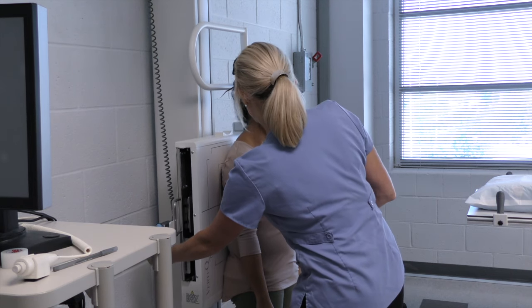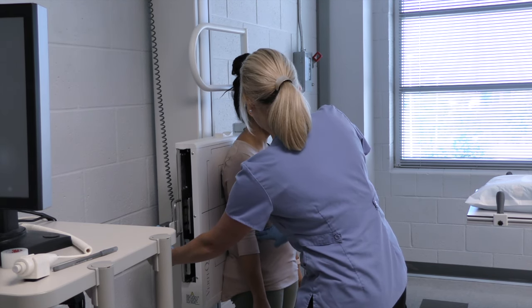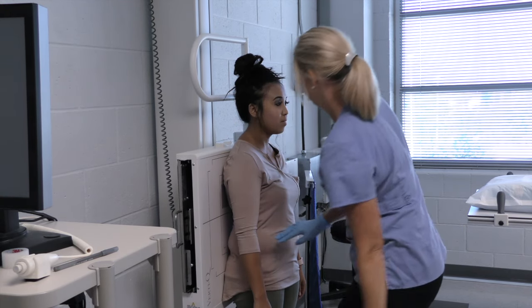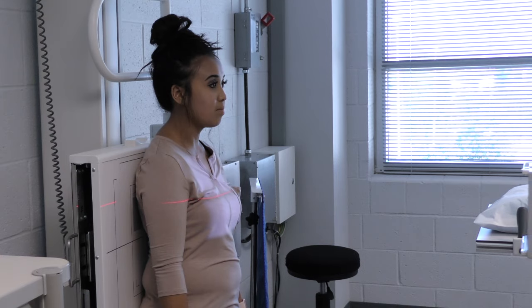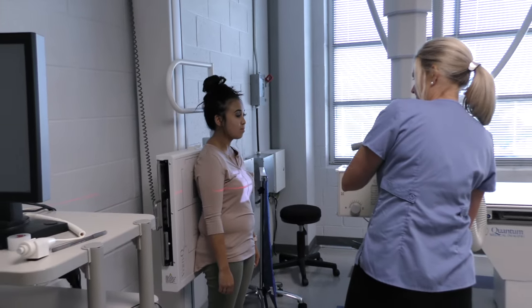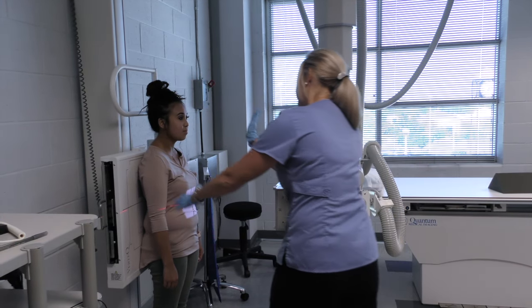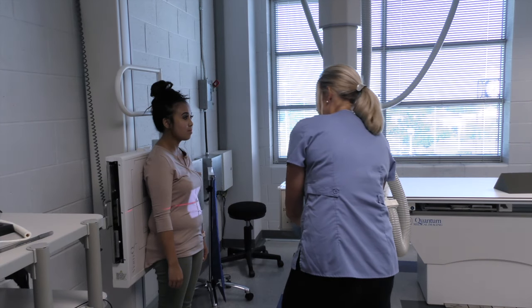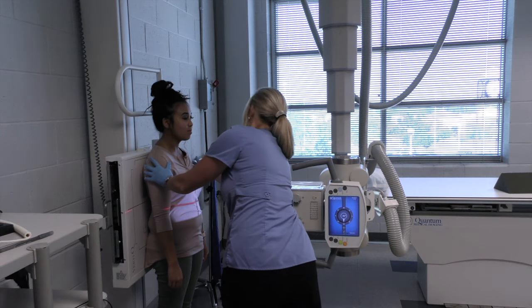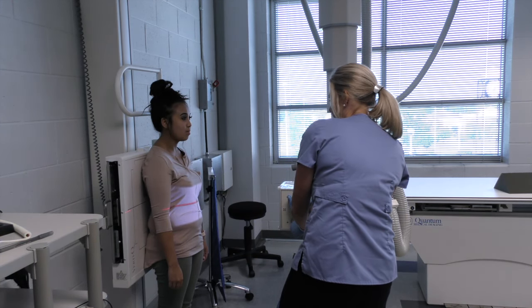We're going to move the board down, so our centering is going to feel for your crest — your hip bone. It's going to be two inches above your crest. Our centering is going to be moved up to 40. Our mid-coronal plane is going to be parallel to the image receptor, so we want to make sure our central ray is in the center of her body.